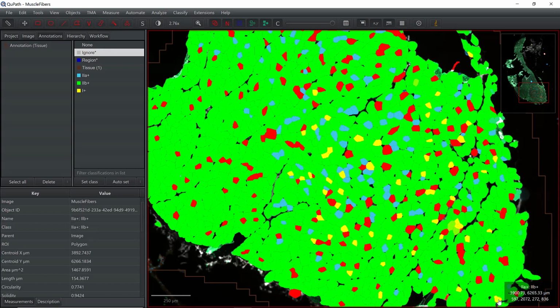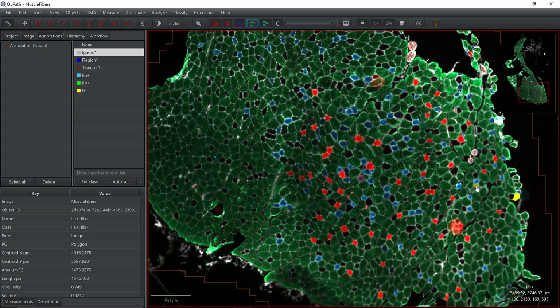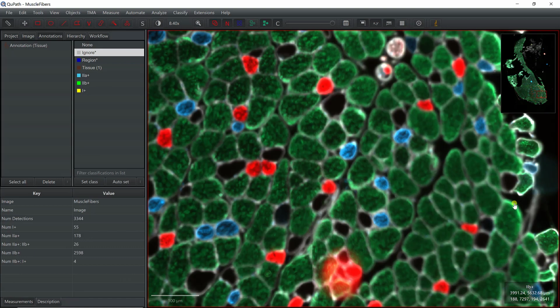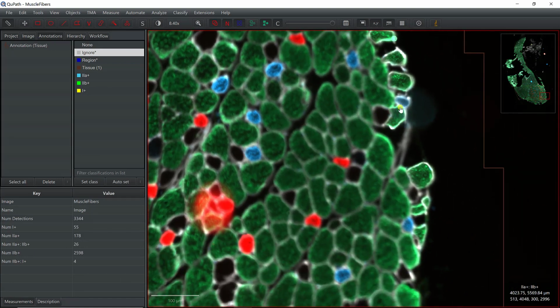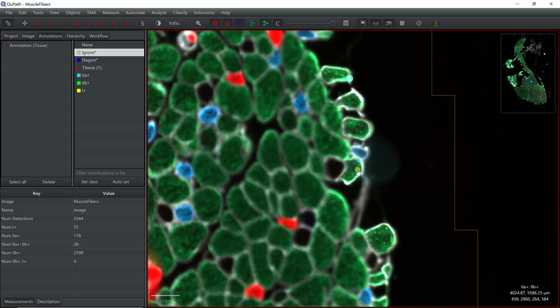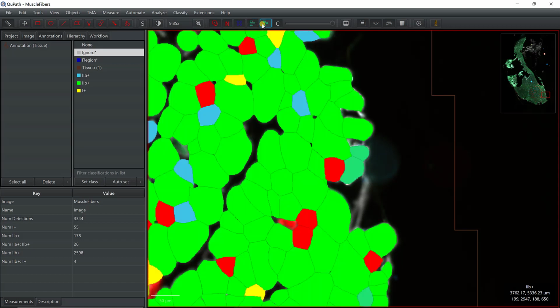So here it's also 2A and 2B, so that again shouldn't happen, like in here. If we look at what we have, it's probably again some saturation. You see the laminin is really high, and so maybe it's probably here. It's not 2B. This is probably just 2A, and this is 2B and this is 2A, and yeah, both were positive for both of them.